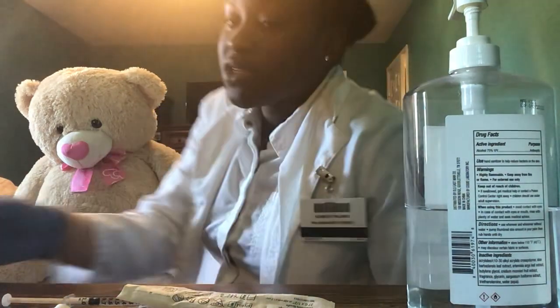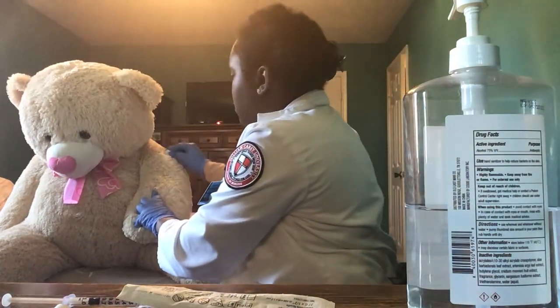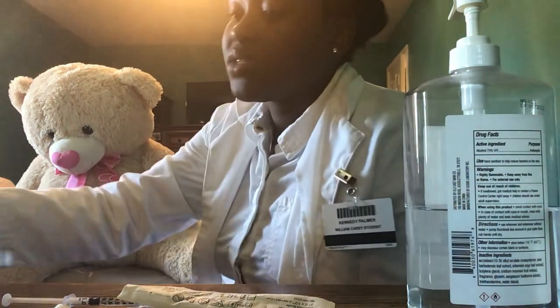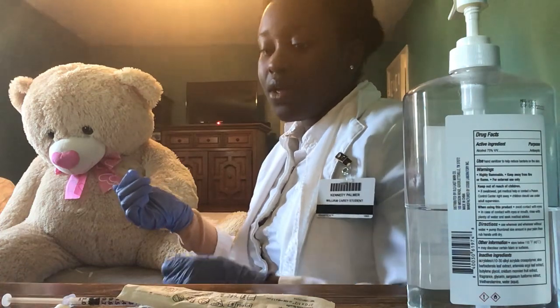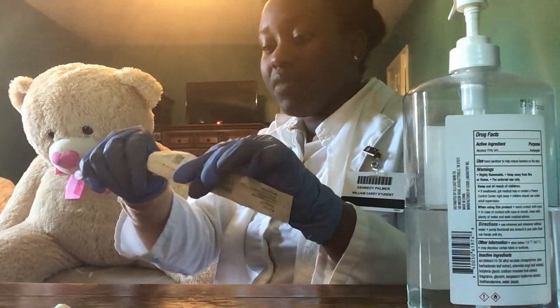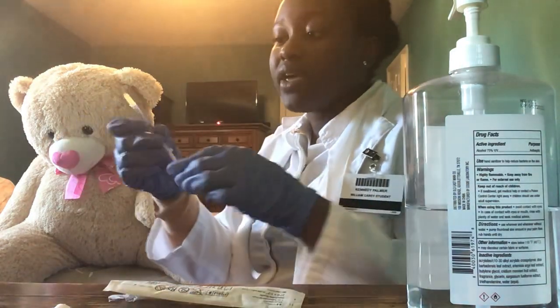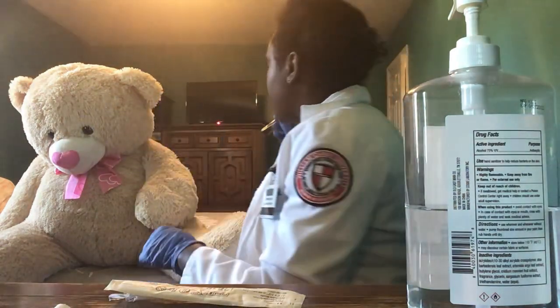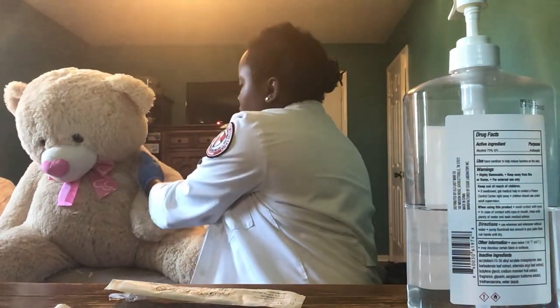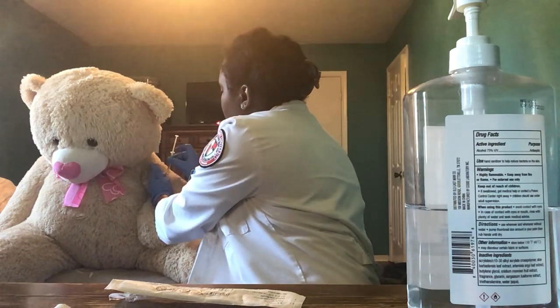Okay. And I'm just going to take an alcohol swab. I'm going to cleanse the site, dispose of this, let the site dry. And now I'm going to give the medication. I'm going to give the medication at a 90-degree angle. I'm going to use the Z-track method, so like that. And I'll be giving the medication at a 90-degree angle.